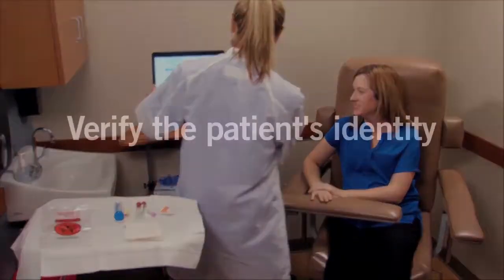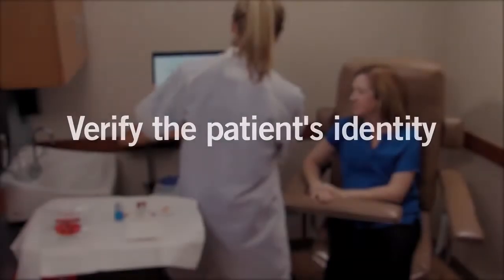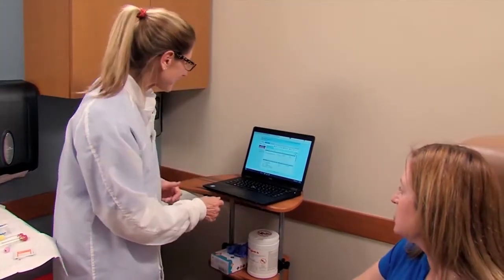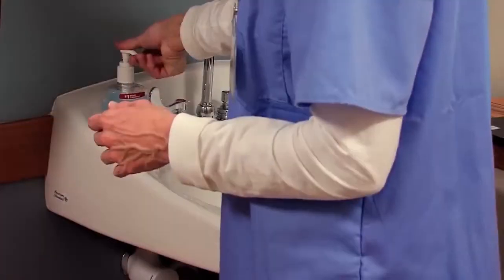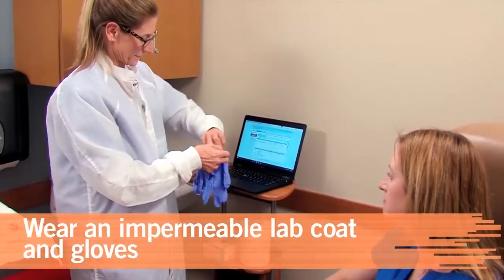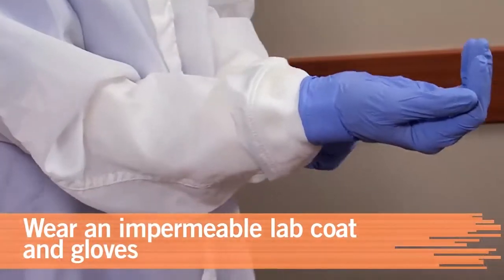To make sure you have the right patient, verify her identity using two identifiers. As part of infection control, sanitize your hands. Wear a fluid-impermeable lab coat and disposable gloves.